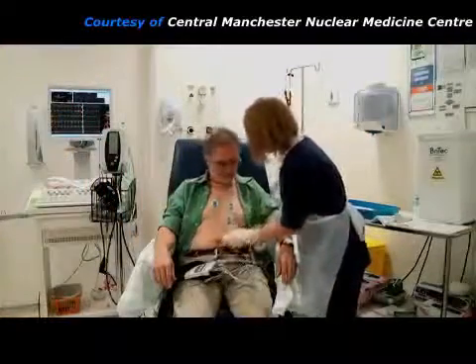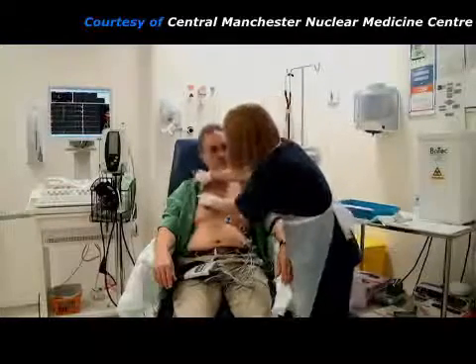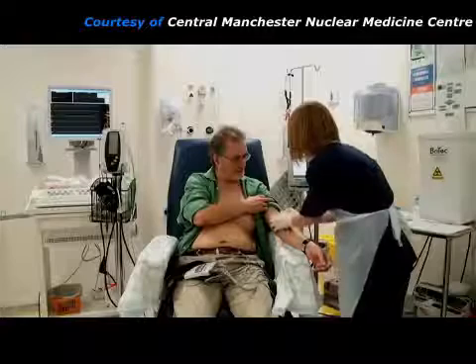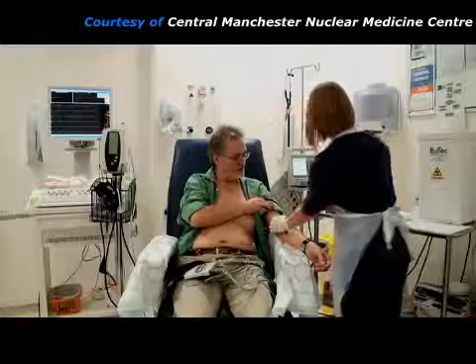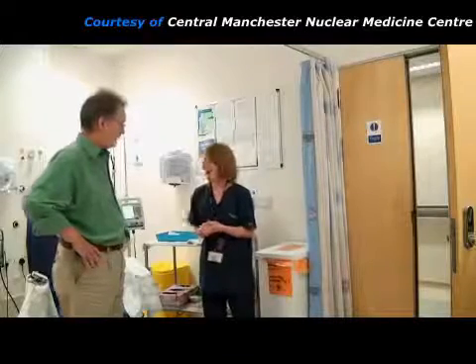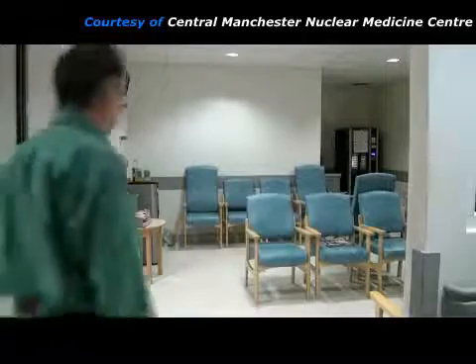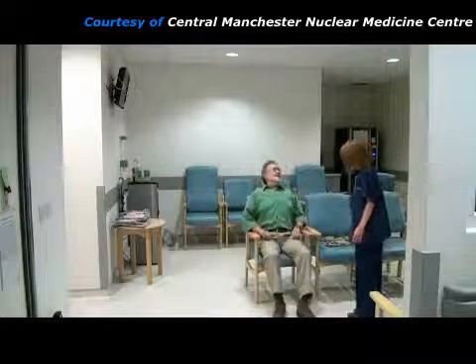The stress injection part of the procedure is now finished. Most of the ECG electrodes are removed, but 3 electrodes are left for use later on. The needle can now be removed from the patient's arm. The practitioner checks that they have fully recovered and are feeling okay. Then the patient goes to a waiting room reserved for radioactive patients. They will have to wait here for about 1 hour before images of their heart can be taken. During this waiting time, they can have a drink of tea or coffee if they wish.